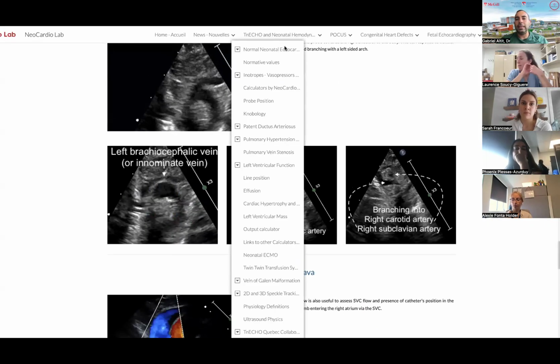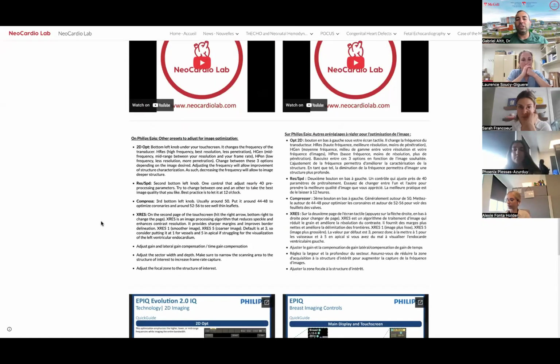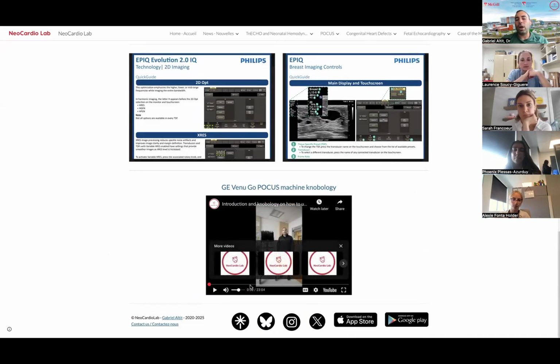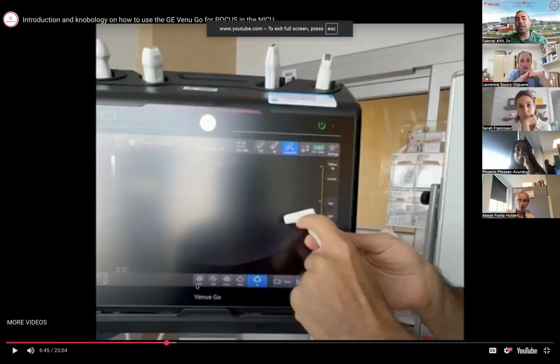I've included a section on knobology specifics on the actual Philips. You may be using the GE Venue Go during your year at the Jewish and at the MCH. So I highly recommend you listen to the little video where I go over where to click on the screen to get your actual probes, and you're going to see that all of the buttons I just mentioned, instead of being on a keyboard, appear here. So you have the B mode, the color, the M mode, the pulse wave, and the continuous wave all here. The other buttons like up, down, and these things are going to be on the lateral panel of your screen.